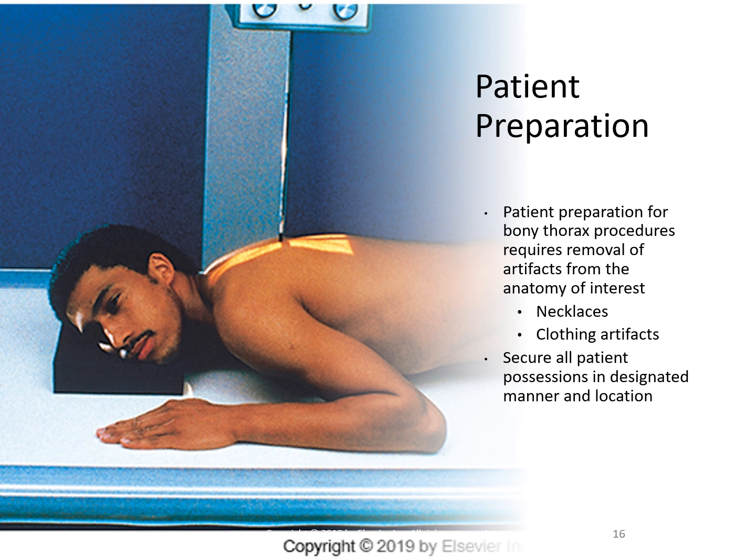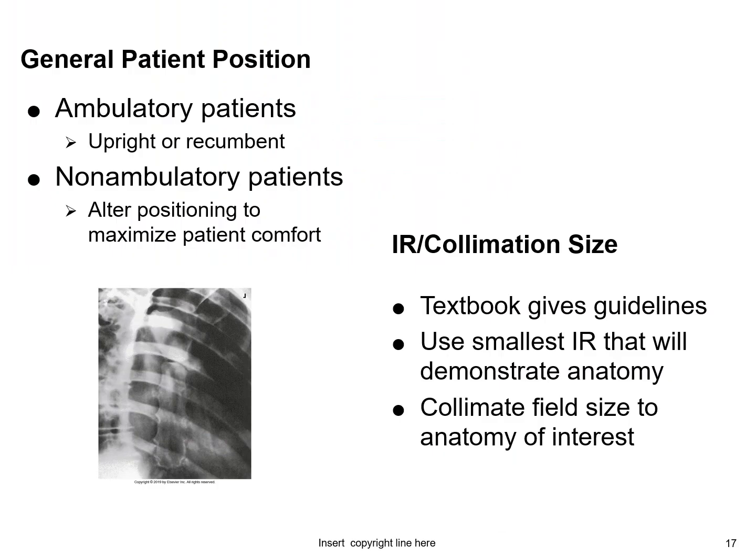The presence of nipple piercings will produce a superimposing artifact that may hide a hairline fracture. Hopefully adding in some obliques will shift their position, and you might be able to get away with not removing them. But you should also offer advice to your patient that it adversely affects the ability of the doctor to diagnose if the nipple piercings are left in.